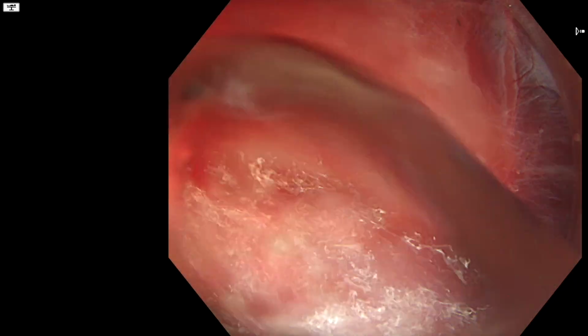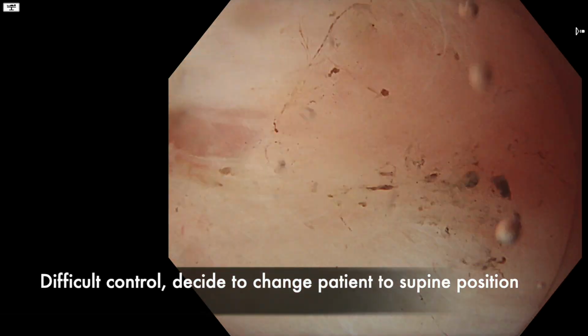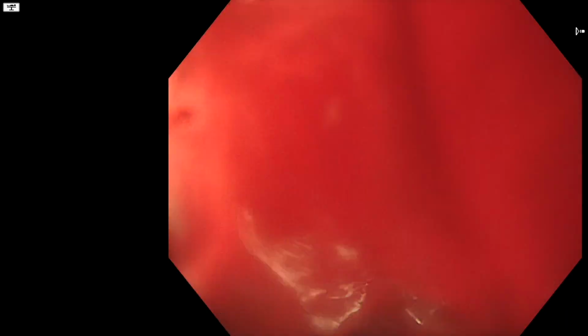But unfortunately, this is a much more serious bleed. It's obviously a thicker vessel, so I decided to try and suction the fluid and shift the patient around, see if I can get the bleed into a non-dependent position.